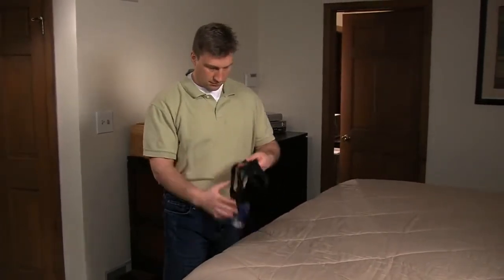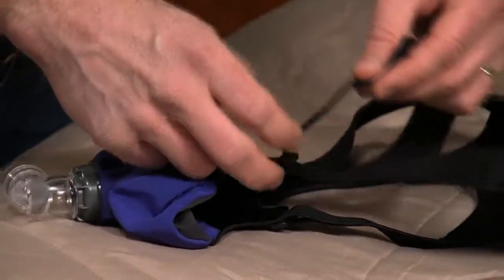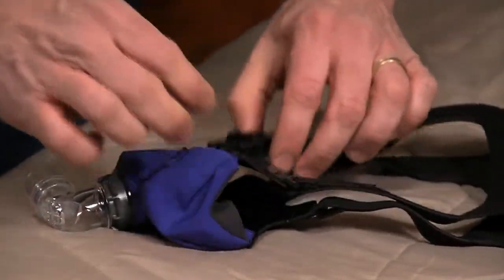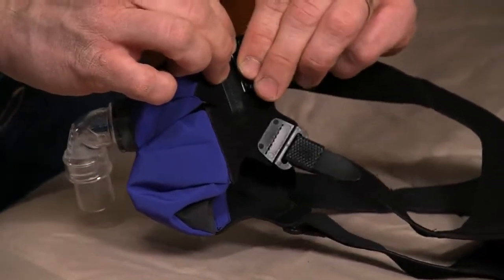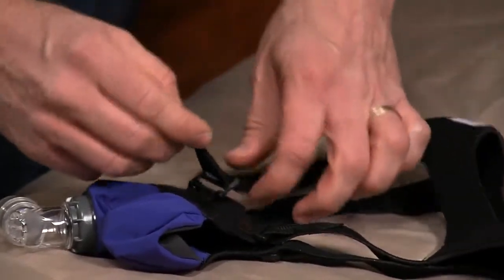Make sure all hook tab straps are attached to the headgear, with all strap lengths at their widest settings. The 2 bottom straps come with a plastic double clip attached to the hook tabs. Simply snap the male double clip into the female quick-release clip on the mask. Make sure each side is firmly attached.